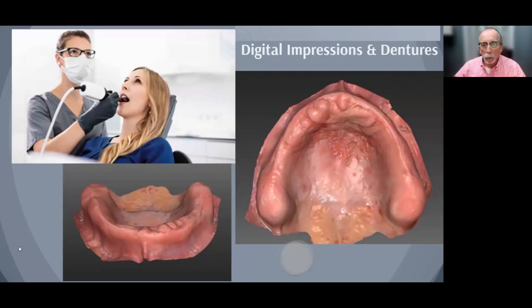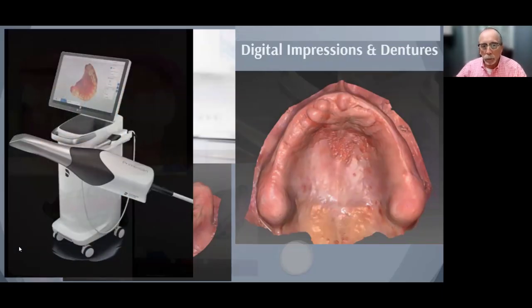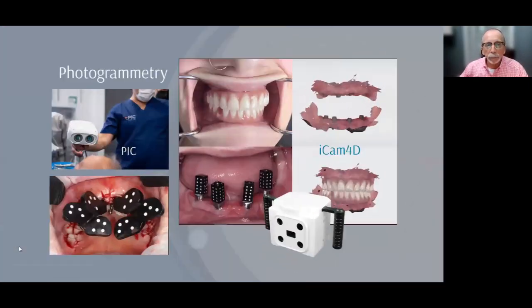even though these scans look great and they're amazing, I think they're the most difficult, challenging scan to accomplish. So what I train dentists is, look, we're going to do some sort of wash impression and scan that. And that's still the major trend. But there are some folks that can accomplish this scan with whatever scanner is out there. But this is by far the most widely taught workflow, where you do a wash impression in the patient's old denture or in a base plate bite rim, and you scan that with the wand, because the wands do that really easily and really quickly.